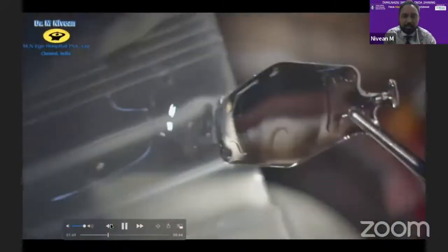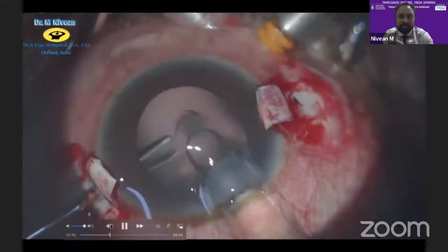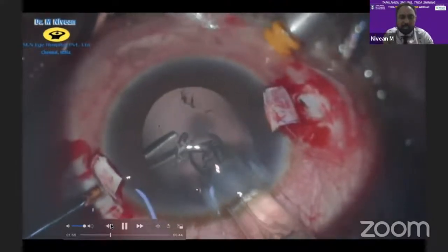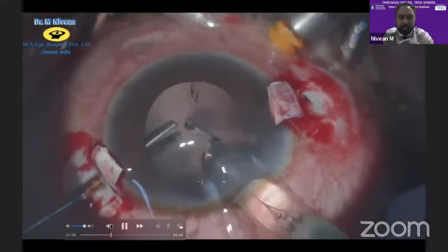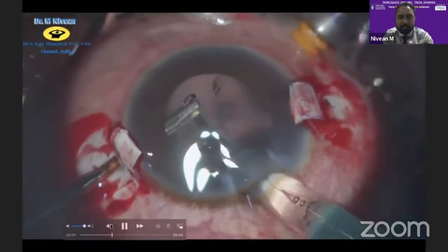So this is the new CM T-Flex IOL. As you can see, the loading is into a simple normal cartridge like any IOL. The only key thing is you can position the T junction so that when you inject it, it comes out first. These are the specially designed Sprenov forceps. You can see those broad tips. So you can grasp either the head or the neck. As you can see, here it grasps the neck.